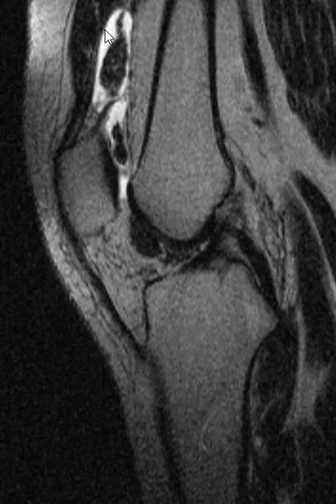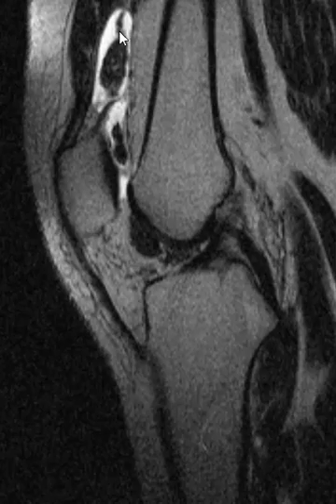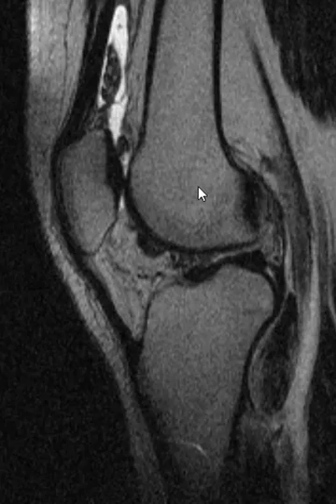Synovial chondromatosis can have more rounded areas — sometimes those calcifications are multiple, more rounded, and more uniform. This case is really not uniform at all; it's amorphous, with some big areas and some small areas. So I believe this to be PVNS. That's it — thank you very much.